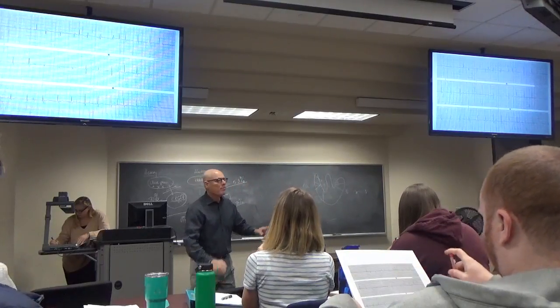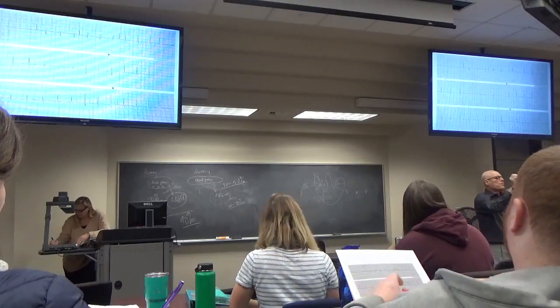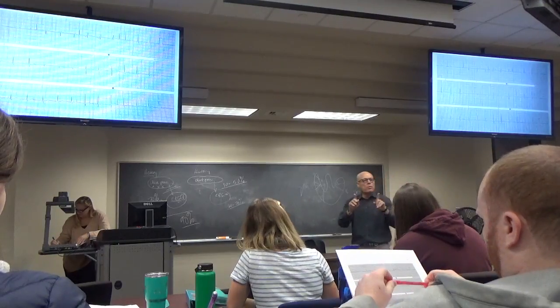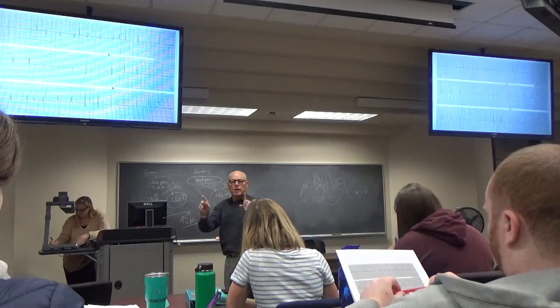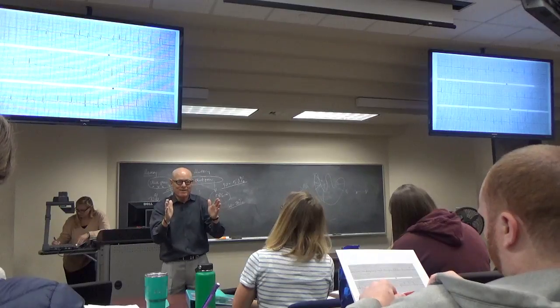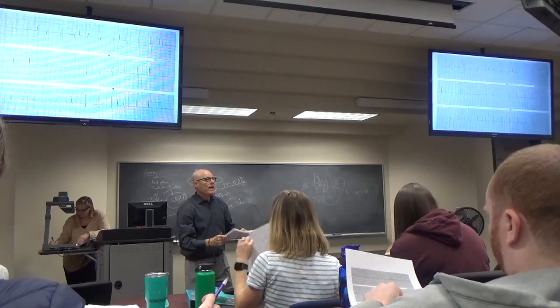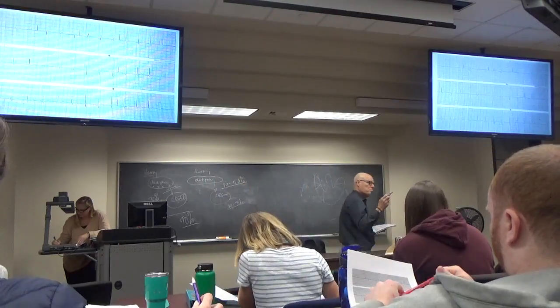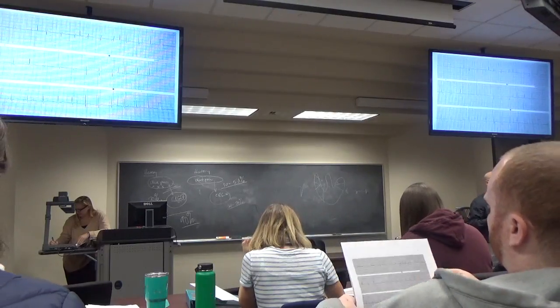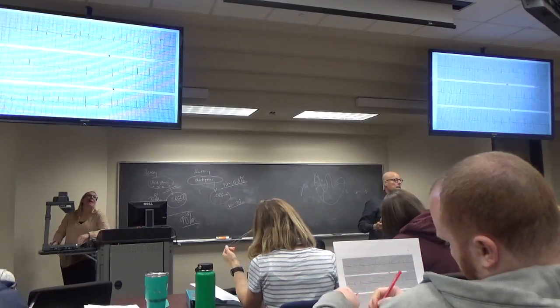So remember this. This is really important. You do the intervals first, and you do them in the limb leads. When the QRS is 0.12 or greater, you look for a bundle branch block. When it's less than 0.12, you don't need to look for a bundle branch block, because it's not in there. But I just told you the other day, several times, bunny ears in V1 are the most powerful finding in EKG. So you want this to be a right bundle. But it isn't because the QRS isn't wide enough in the limb leads.